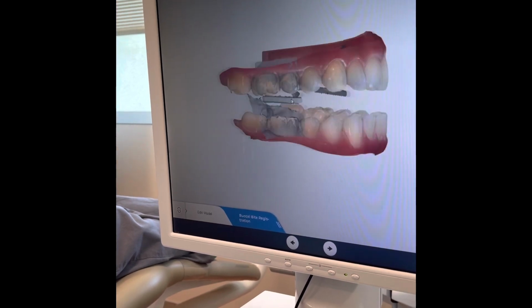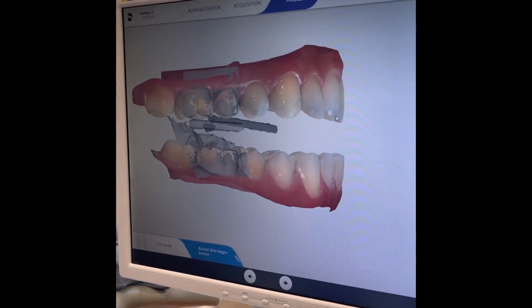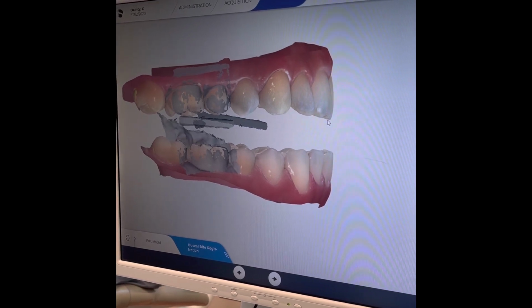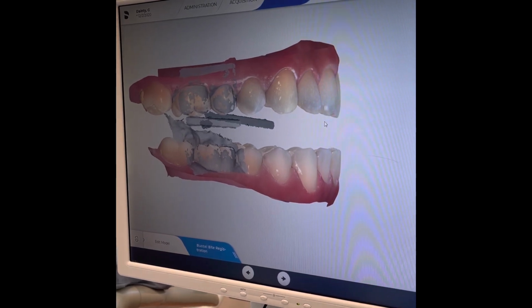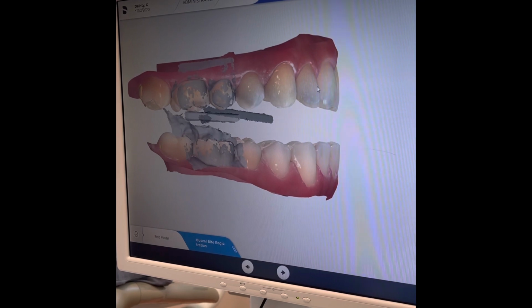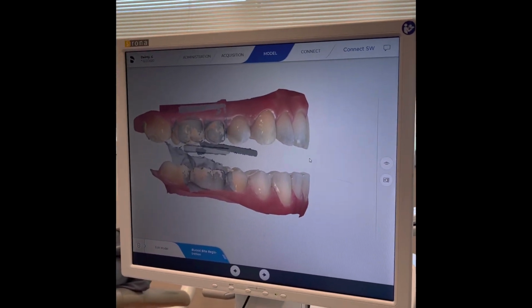Now when you look, you can see Dr. Dainty is pretty much in an anterior, almost edge-to-edge position. So being edge-to-edge, assuming she has a normal class 1 occlusion, we're actually going to be a little bit beyond that 50% mark of protrusion because we kind of have to jump that gap from the lingual of our central incisors to be slightly beyond. So, which is what we see, we're at about 60% in the protrusive record we took.